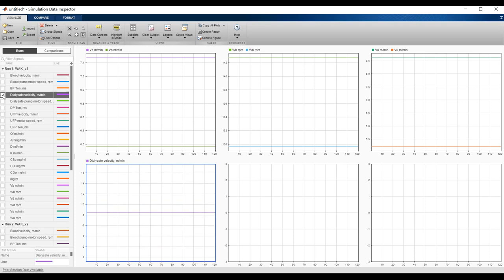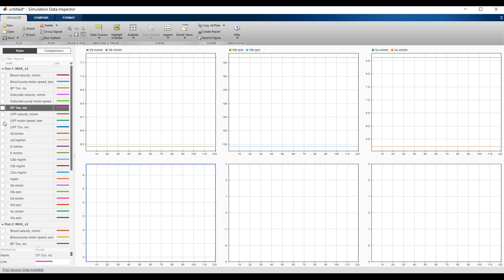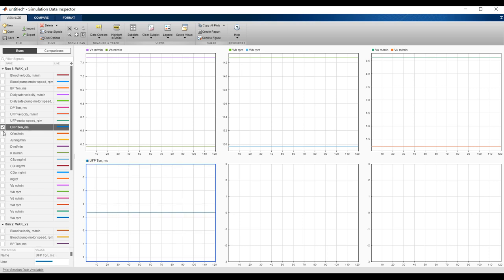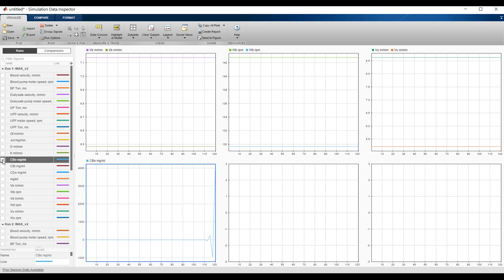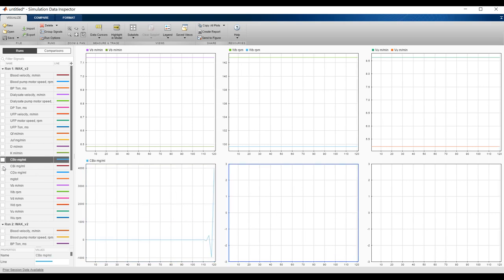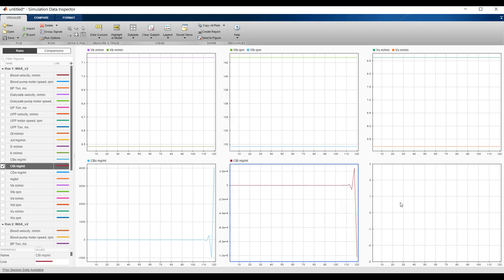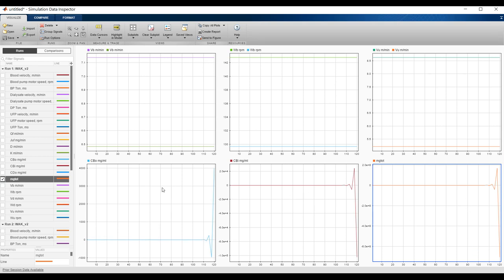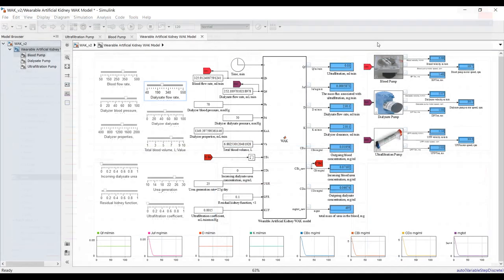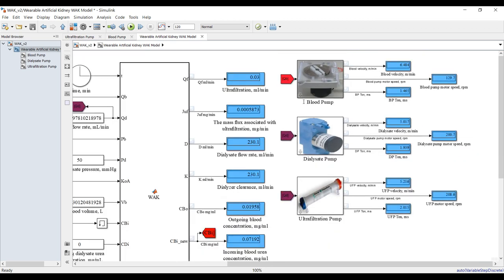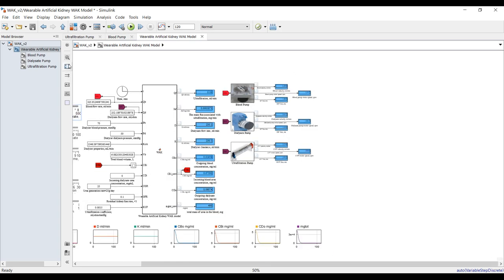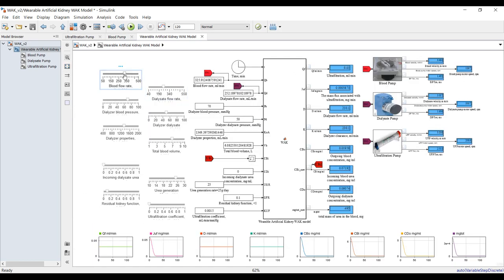The results show blood velocity, blood pump motor speed, pressure difference, motor speed, and flow rate. We also have blood concentration: blood inlet concentration and blood outlet concentration, varying according to your parameter changes. This is the main result — if we change the blood parameters, the outputs change accordingly.